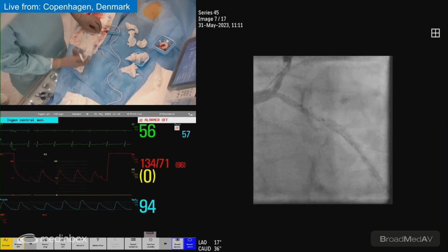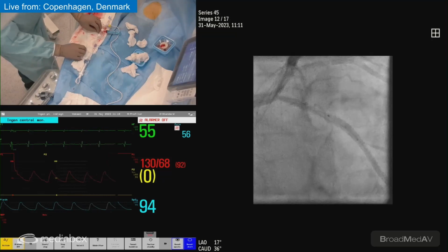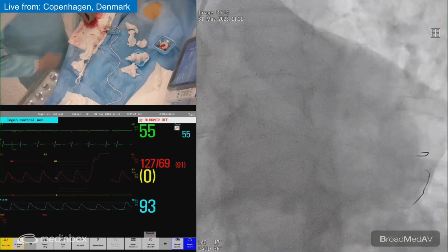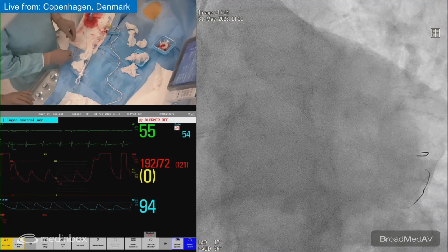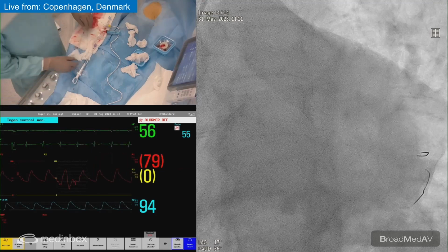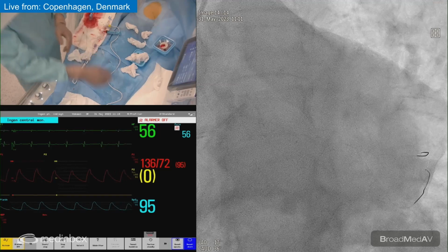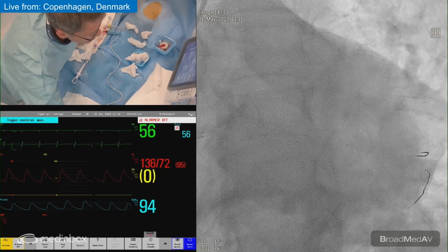Yeah, so that means we're going to need a 15 stent, right? Yeah, exactly. And you have a 4.0 15 stent. And the reason for using these stents in our institution is that that's part of the tender that we have. So that's the reason.